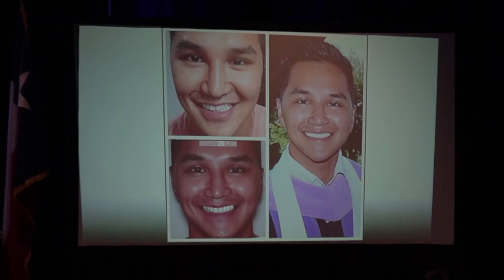You've got a digital design process. In the analog world, the lab guy would mess this up. Unless you got your face bow and articulator perfectly right, you can do it, but it takes a lot of time and a lot of skill. We're mentioning these very aesthetic dentists. You would do this case by doing a composite mock-up in the mouth. Sometimes those guys are spending 1 hour, 2 hours adjusting all of that in the mouth. That's too much for me.